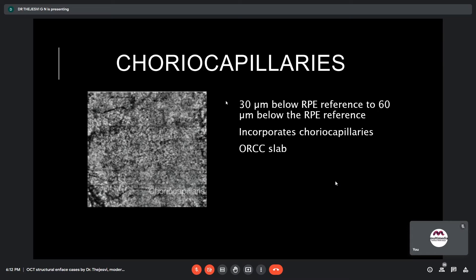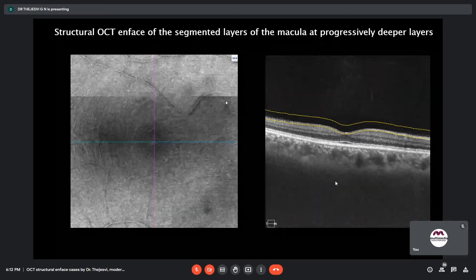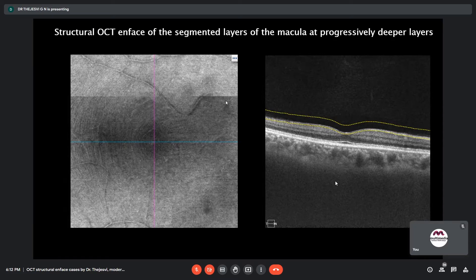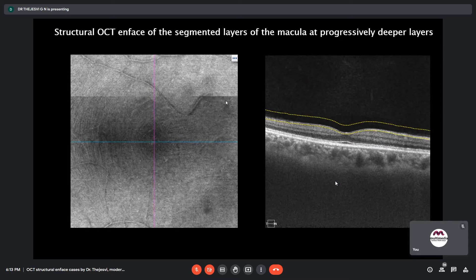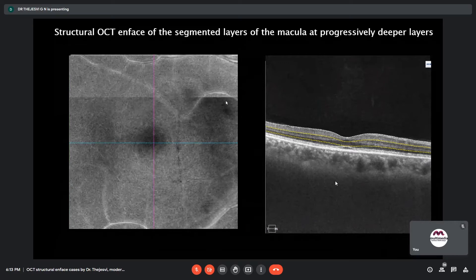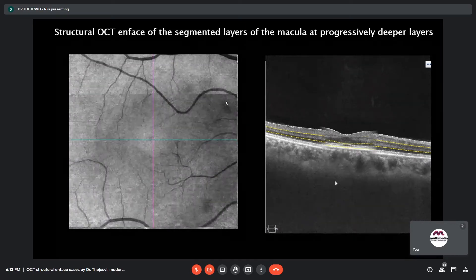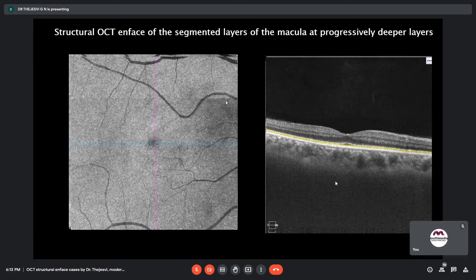Here we can see a structural en-face view of the segmented layers of the macula at progressively deeper layers. The VRI slab at the vitreo-macular interface provides structural and dimensional details of ERM and macular holes, which can aid in surgical planning. In the middle retinal slab, different patterns of paracentral acute middle maculopathy lesions can be better appreciated. In outer retinal slabs and the ellipsoid zone junction slabs, structural OCT en-face helps identify margins of geographic atrophy and quantify disease progression.